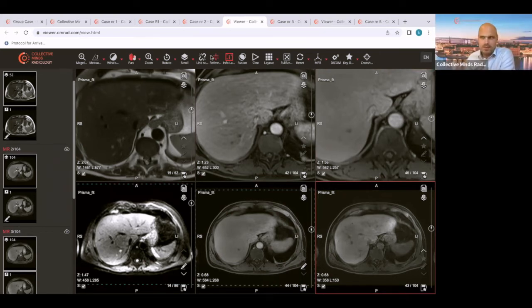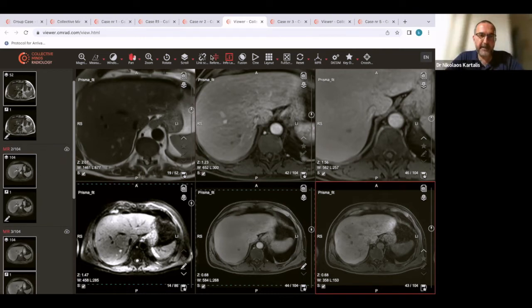So we have 60% answering so far. So maybe we'll end the poll here. Yes, please. Let's see the results. Here we go. Okay, this is a derby. So we have 31% saying hemangiomas and 54% saying metastasis.